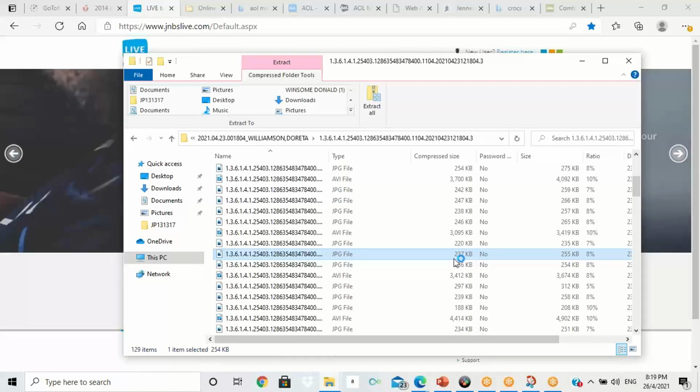You need to get the images that are necessary to make an assessment, but you don't want to spend too much time. You don't want to waste time.